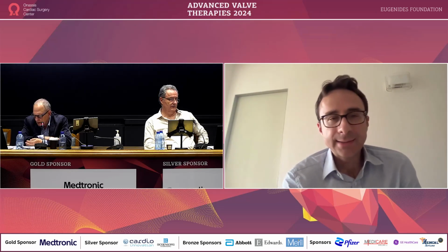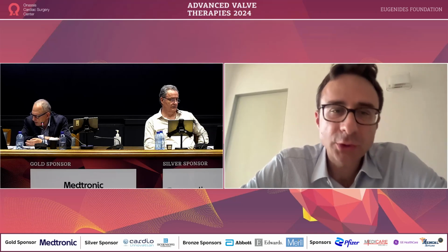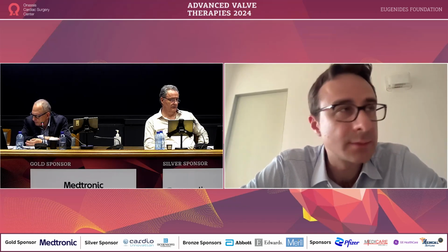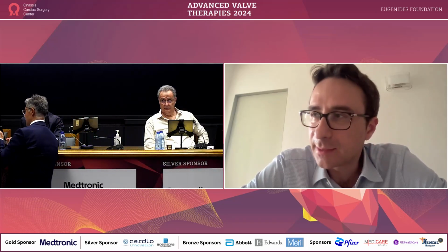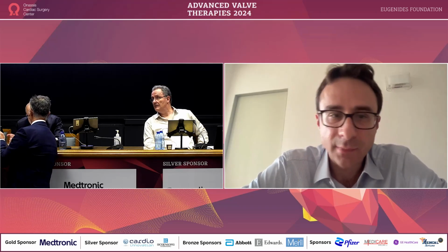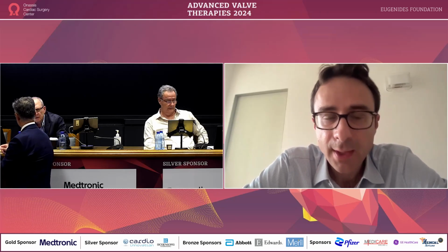So maybe this was not clear in my presentation, but I always assess the final result before the deployment with both the angiographic injection and the transesophageal echo. But mainly, I'm guided in my decision to accept or not accept the final result by the transesophageal echo.